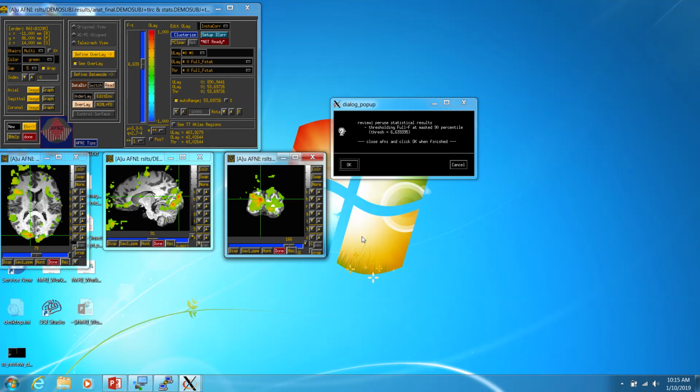It's a sign that something's different about that person. And when you move from level 1 to level 2, which we won't really cover here, but it's really important, you want to be able to see that you are not putting anything strange into that secondary model. Because if you have really weird data, if there are a lot of missing voxels, you're missing whole parts of the brain in your level 2 analysis that you wouldn't get otherwise.